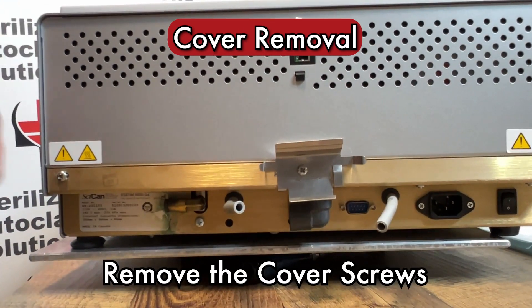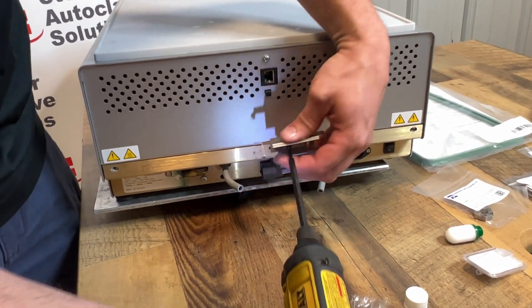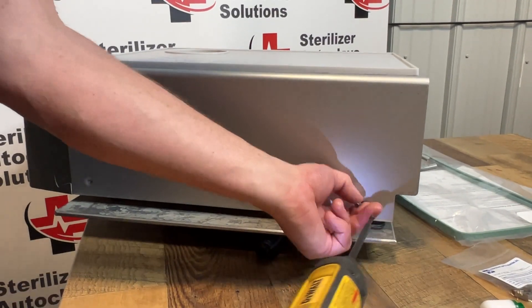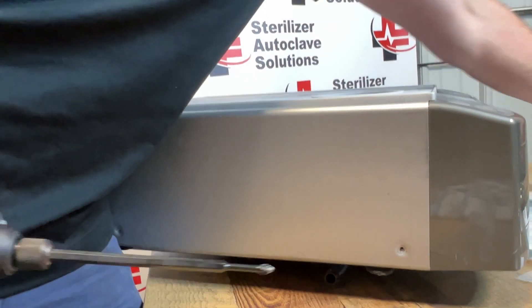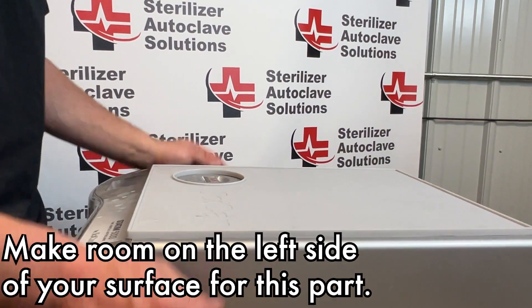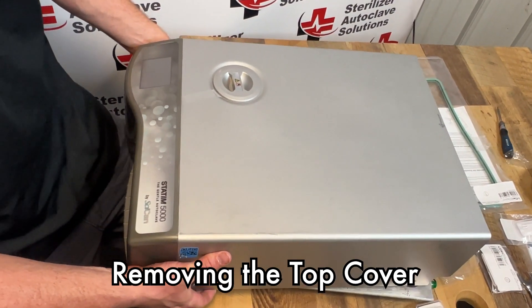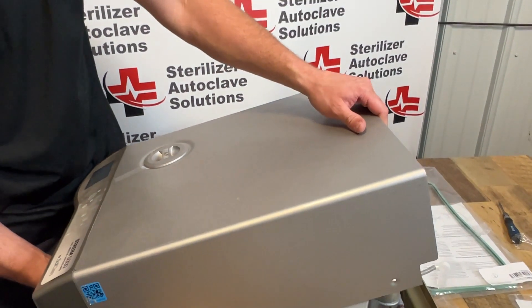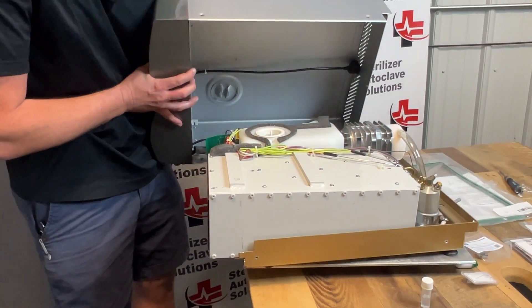Next, there are seven screws that hold this top cover on — three in the back. The one located in the center of the bracket: the bracket will come off with it. There are two on either side. Once all seven screws are removed, make sure you have room on the left side of the unit. Bring the front legs to the edge of the counter so the front can tip up. Grabbing the back of the unit, lift up and slide the entire top cover forward. Once you feel it clear, roll this top cover off to the side.